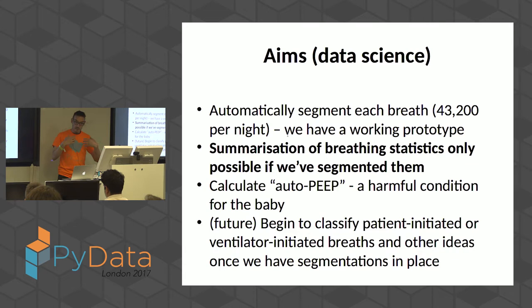So if we can summarise when each breath is taking place, we can then start to apply some statistics to analyse that data and say which breaths look good, which breaths look bad, which pieces of the nighttime or the last N hours a doctor should go and check over. But to do that, we have to do segmentation, which we'll cover shortly. That lets us go on to do some really interesting other areas of analysis.